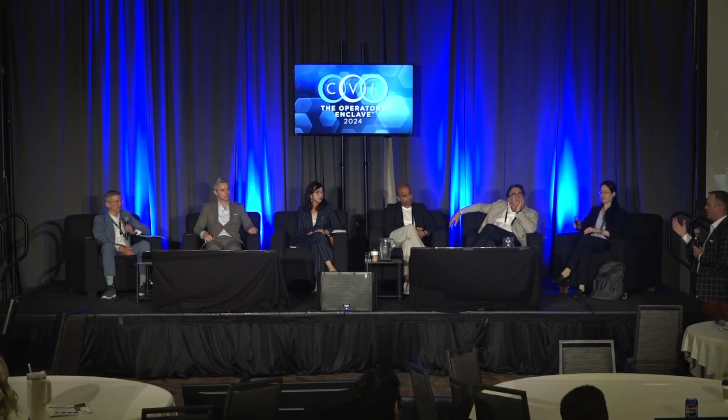In other discussions we've had about ways to even formally study this, we've talked about the thrombus character being an important element. Soft thrombus was clear here. I didn't show as many moving echo pictures, but it had that wispy, soft appearance, and on her serial imaging that we had lots of, it was kind of different shapes. So it was clearly not a chronic, scarred down kind of thrombus.